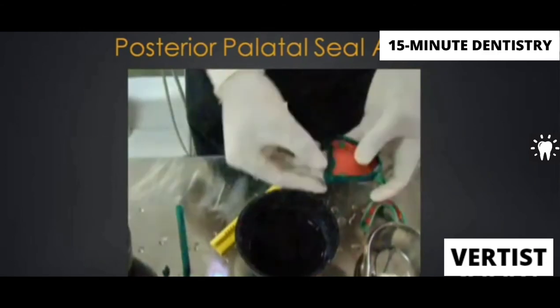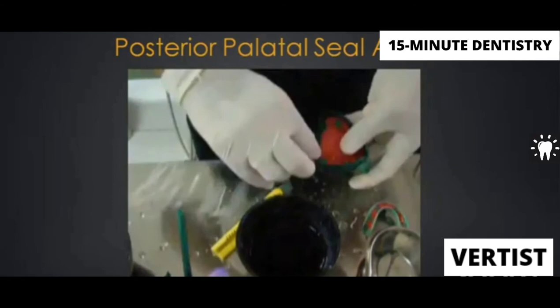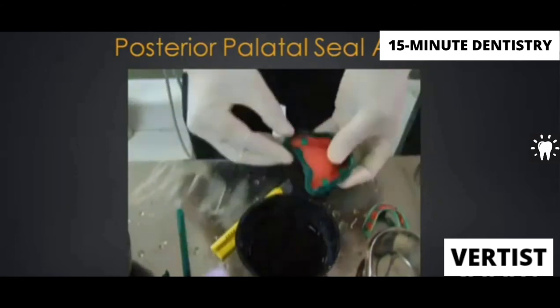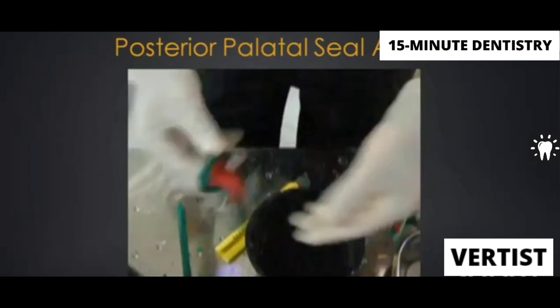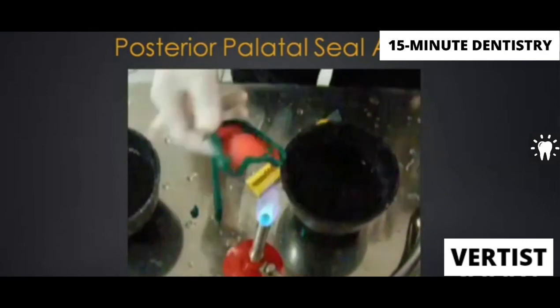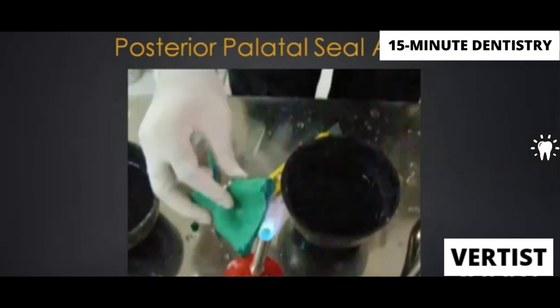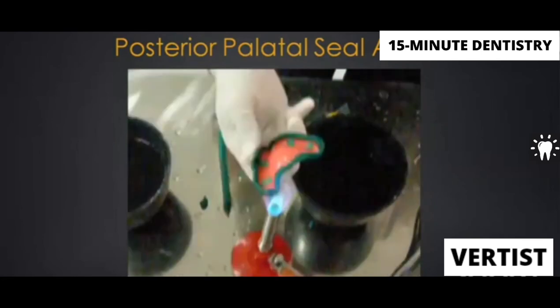Why is it cupid bow shape? I'll show you in the next slide. But again, very important, nothing beyond the tray. For the posterior palatal seal, it has to be on the tray, not on the wax, not beyond the tray, on the tray. Because we have trimmed our tray till the posterior vibrating line, our material should also be till that part of the tray only, should not go beyond.